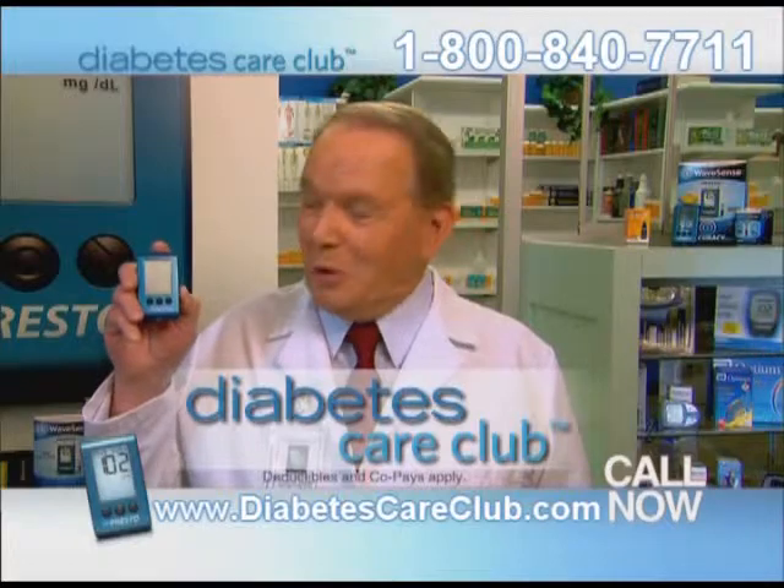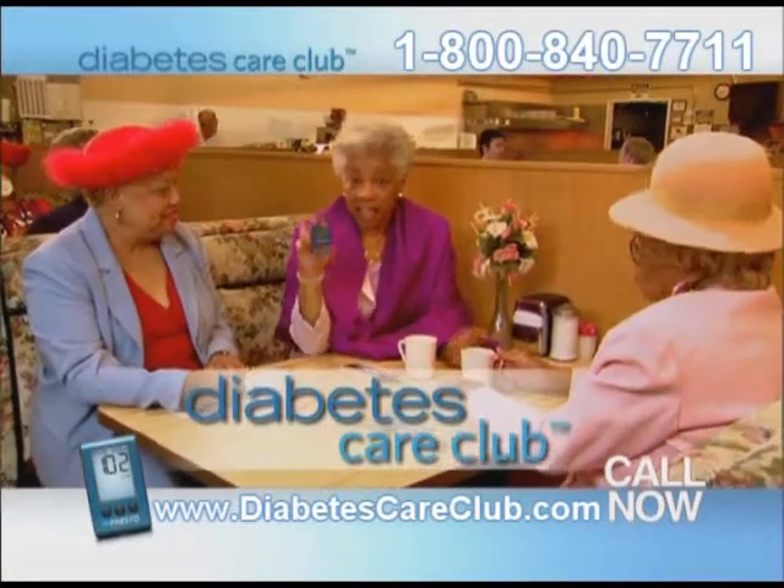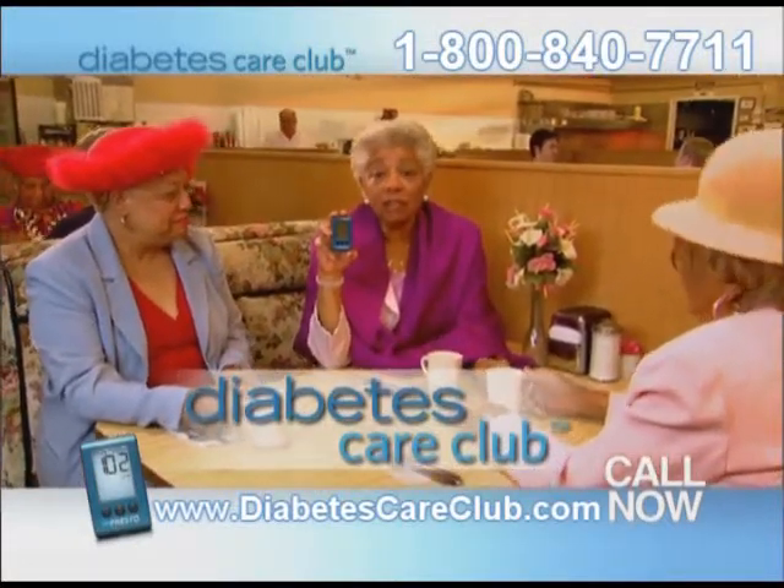And the best news is that Diabetes Care Club will send you one of these new meters. I called, got my no-code meter, now my fingers don't hurt anymore. Diabetes Care Club delivers the latest technology directly to your door for free.